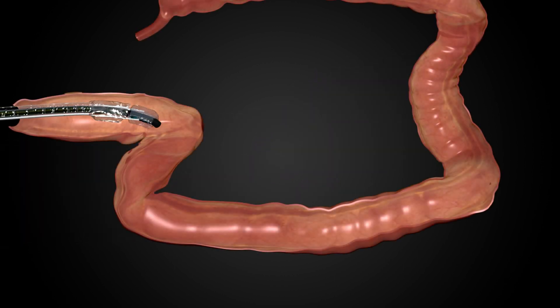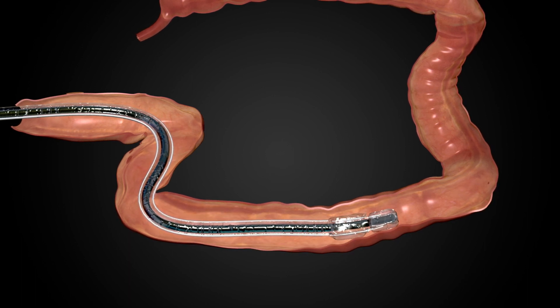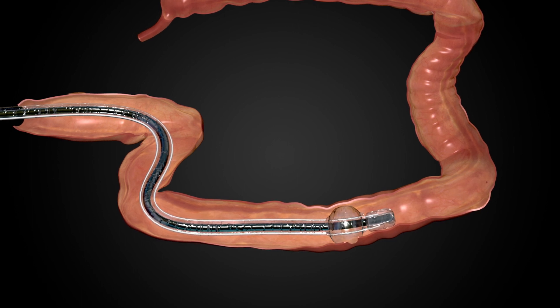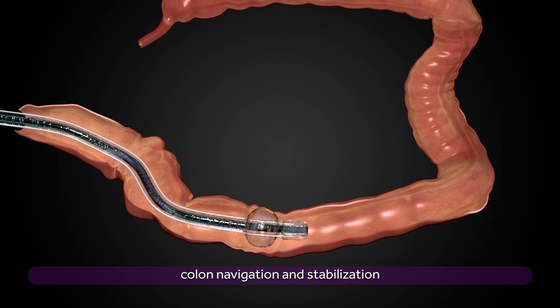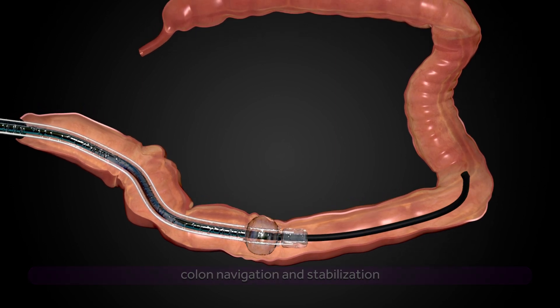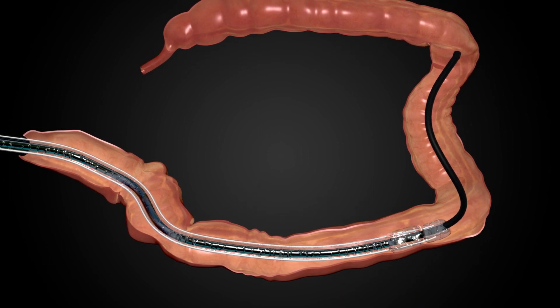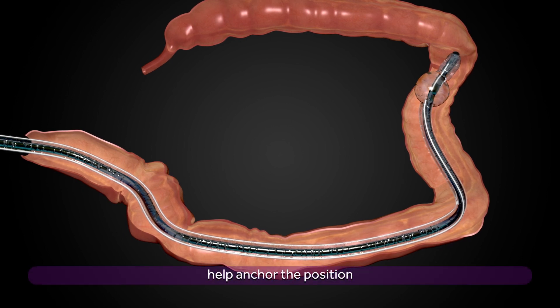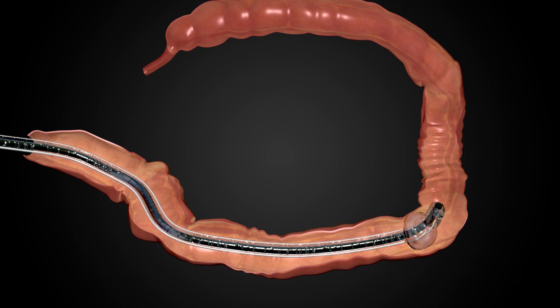In response to these challenges, Lumendi has developed the DiLumen endoluminal interventional platform, which consists of a soft flexible sheath that fits over standard and small diameter colonoscopes. DiLumen provides a conduit to the therapeutic site and employs two balloons to aid in colon navigation and stabilization of the anatomy and endoscopic tools. Once the endoscope and DiLumen are inserted into the patient, DiLumen is designed to serve as a conduit to the therapeutic site, with the balloons used to hold the device in a fixed position while the endoscope advances forward.